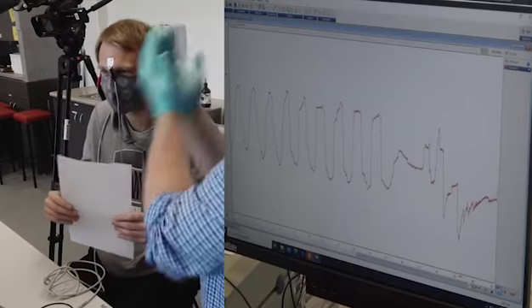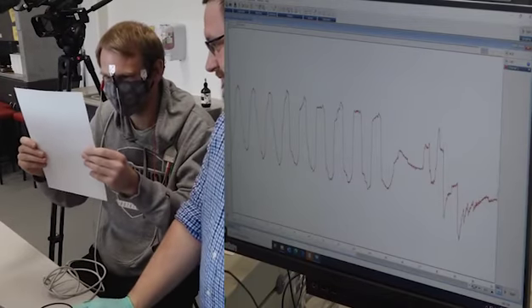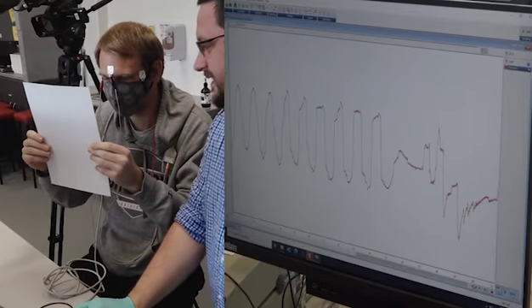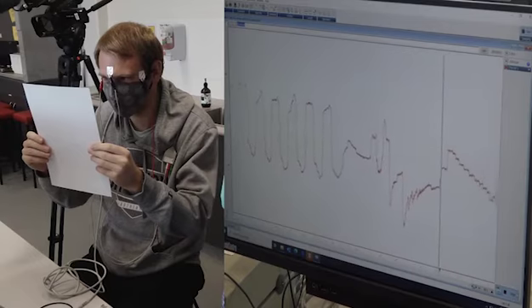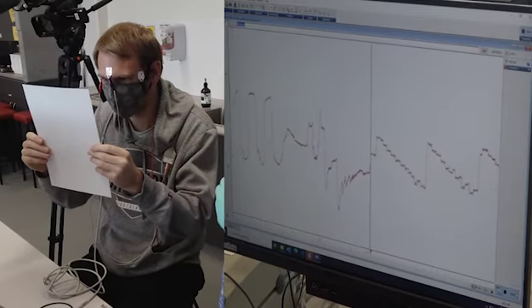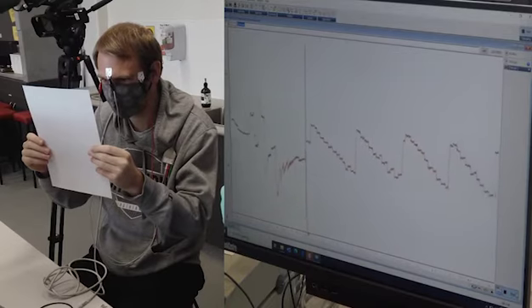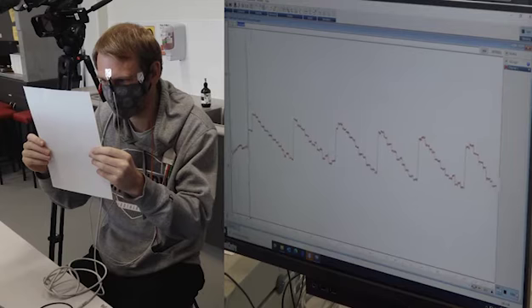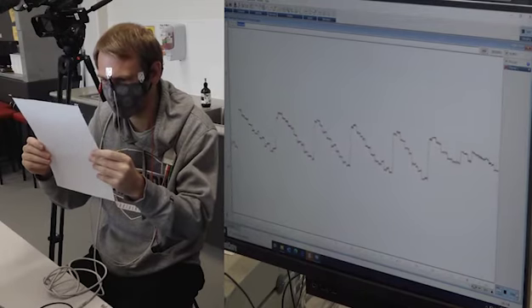So just hold it directly in front. Yep. And go. And on with the hard then.